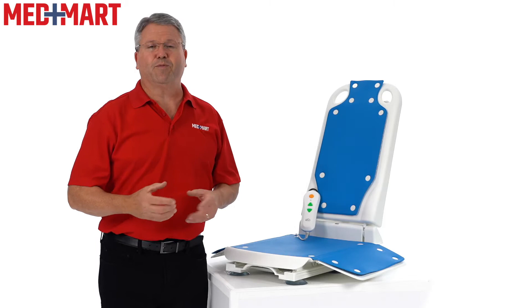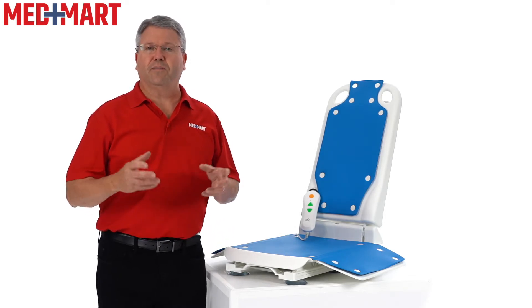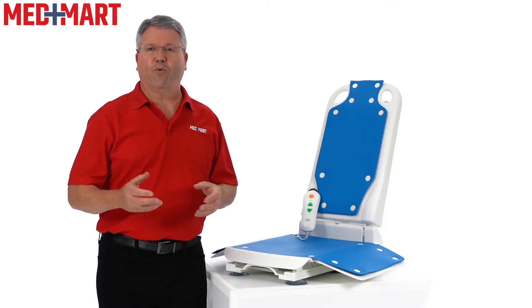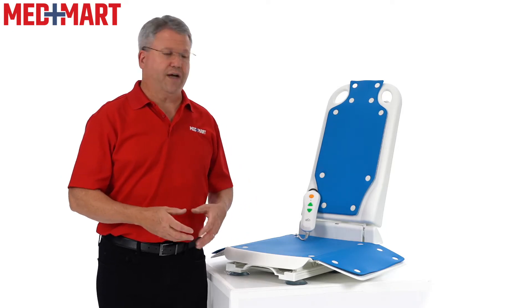My name is Jeff, I'm a product expert here at MedMart and I've been a registered nurse for over 25 years. This is a lower cost option compared to a walk-in tub or walk-in shower, but it's also comfortable and supportive. It features a 300 pound weight capacity and comes in four different colors to match your style.